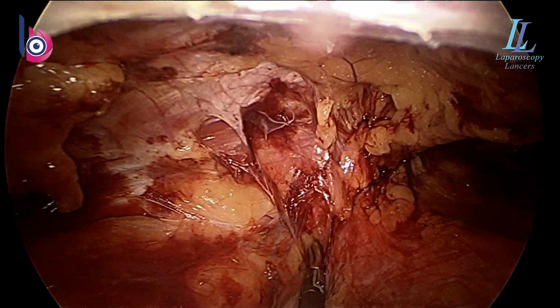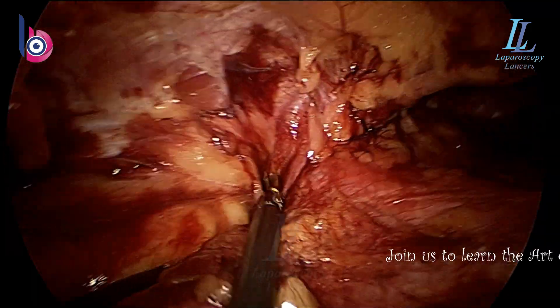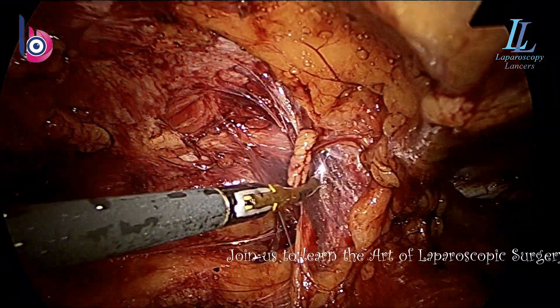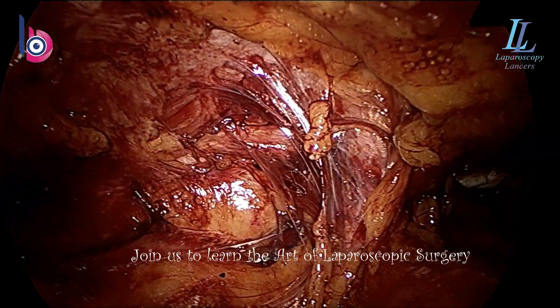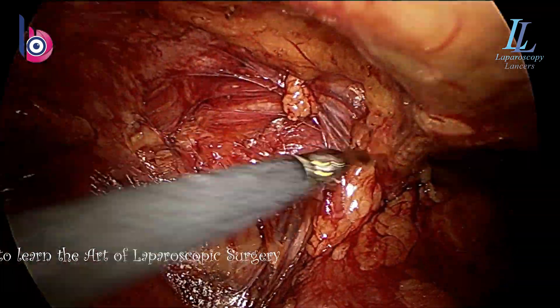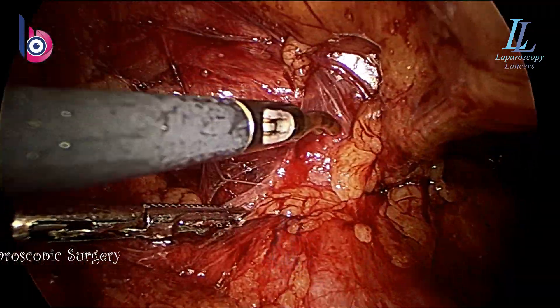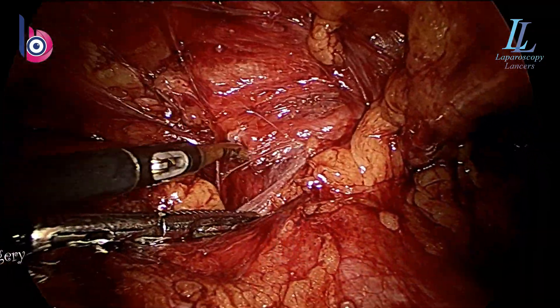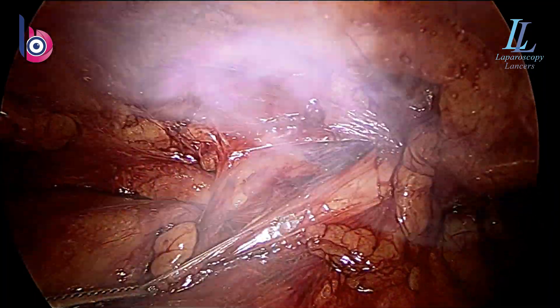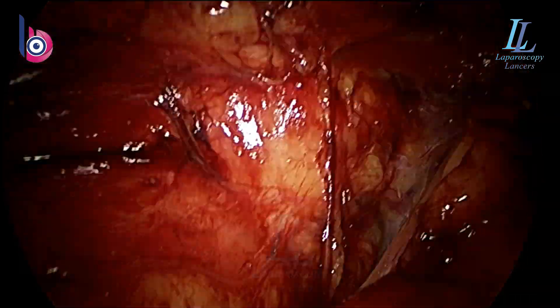Start with TAPP, then graduate towards TEP. There I am reducing the sac. The limit of the dissection posteriorly is the vas deferens turning medially and superiorly. You can see I'm pushing the sac back with a bit of blunt and sharp dissection. Energy should be used in very, very short bursts — only a fraction of a second and that too in low, low voltage mode. There you can see the sac, and I'll confirm that it is the sac only and how big it is.